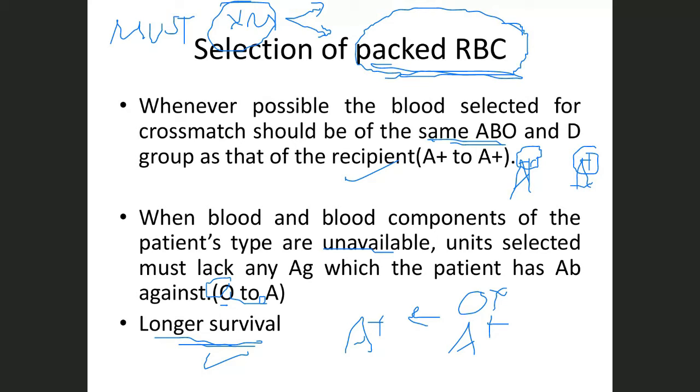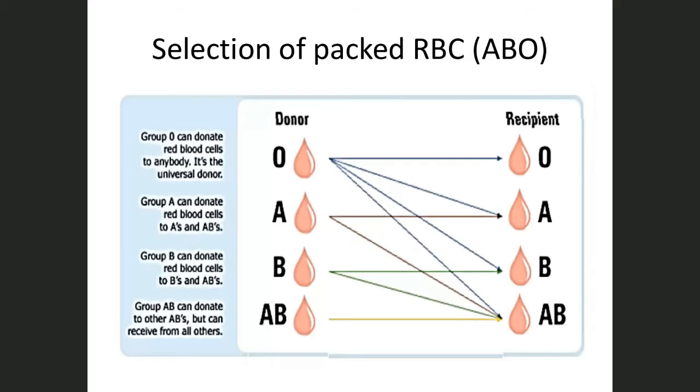So usually we detect ABO compatibility first, and the investigation looks at kidney function, because it may affect the kidney and cause kidney failure. Here we already know the compatible blood. O donor is the universal donor, it can give to all blood units. The AB recipient is the universal recipient. Can you see how many lines go inside it? It can take from O, A, B, and AB.